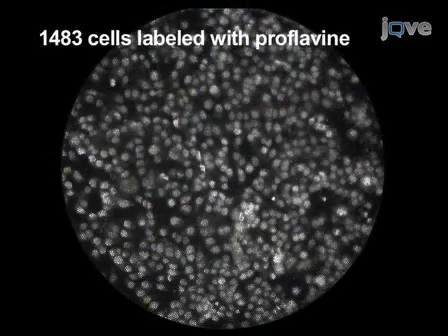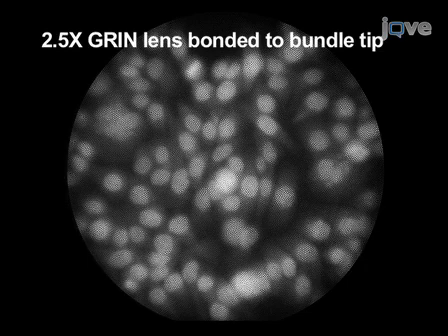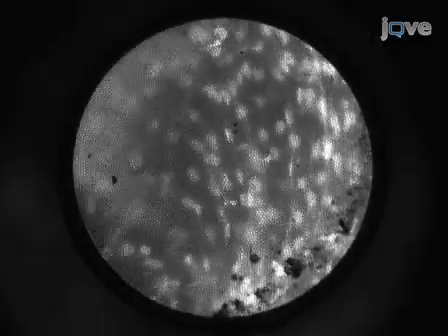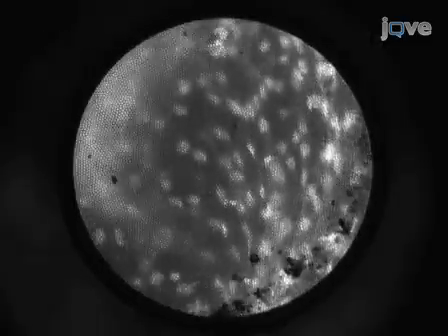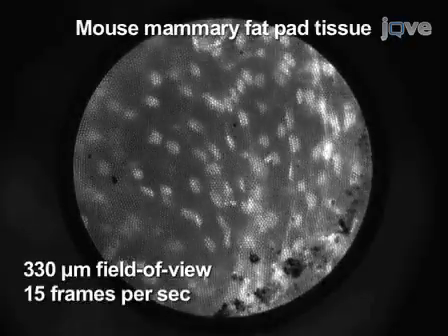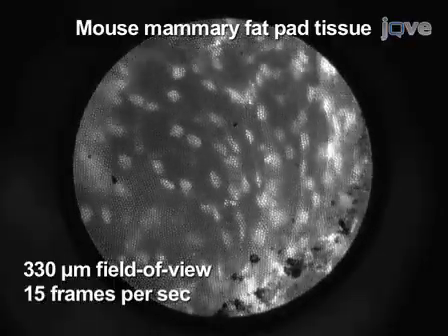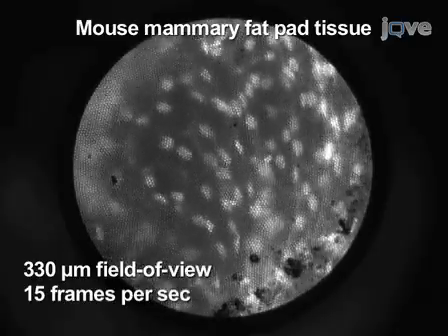Cells were labelled with proflavin, and the bare fiber bundle was lightly placed on the sample. In vitro imaging is shown here. When a 2.5x grin lens was bonded to the bundle tip, an improvement in spatial resolution and reduction in field of view was achieved. In vivo imaging, in which a fiber bundle with a 0.5 mm outer diameter was passed through a 21 gauge needle and advanced into a mouse mammary fat pad tissue, was performed. As seen in this movie, adipocytes are clearly visible, with motion due to the cardiac cycle.